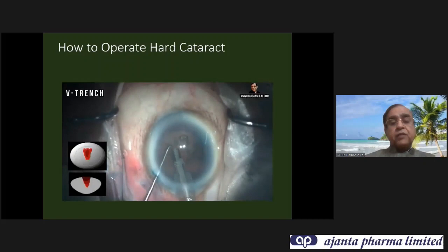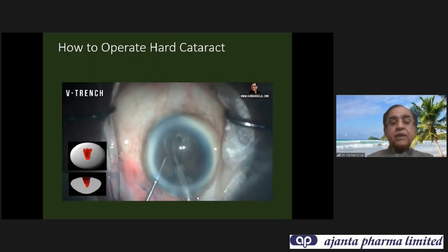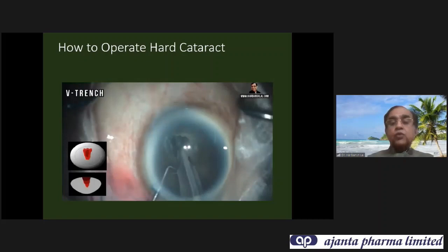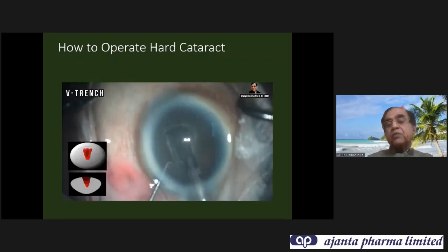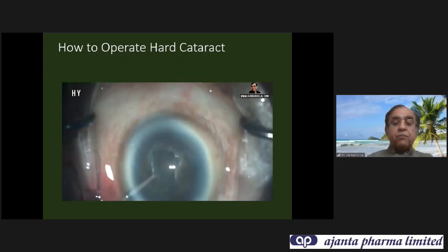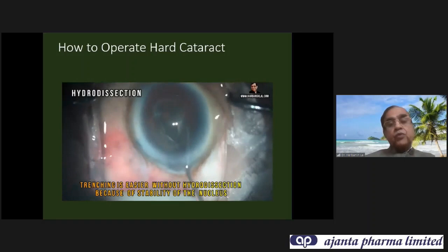The full version of the V-trench technique is on my YouTube channel. In V-trench, we make a much wider V-shaped trench and a radial split. V is both horizontal and vertical. I start at a paracentral area — not at the center — because starting at center causes the tip to keep slipping. For hard cataracts, I do not do hydrodissection initially because once done, the hard nucleus starts rotating in the eye, making trenching very difficult. Once 80% of the trenching is complete, I withdraw the chopper, inject viscoelastic, withdraw the phaco tip, and then do hydrodissection. After hydrodissection, rotate the nucleus to ensure the trench is wide and deep at the center before splitting.